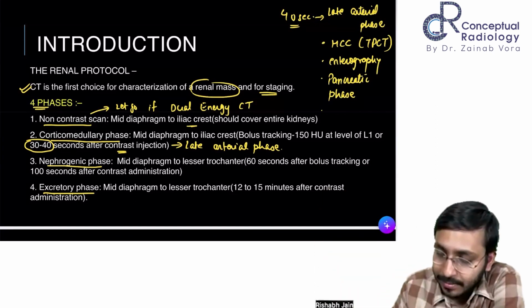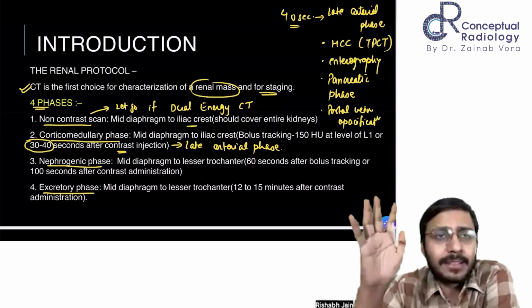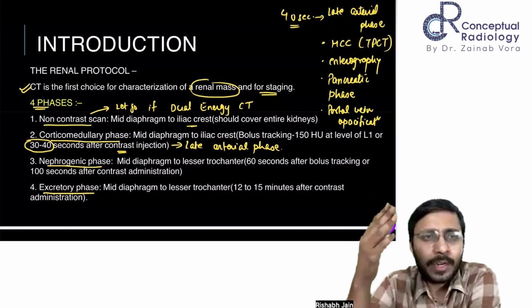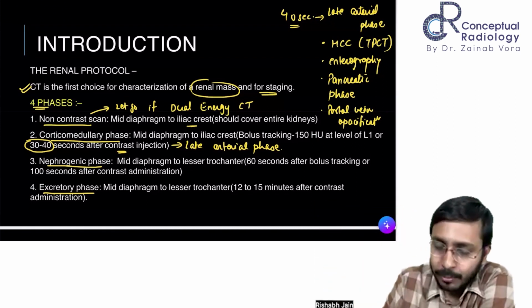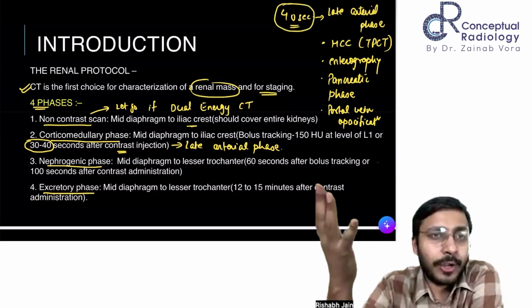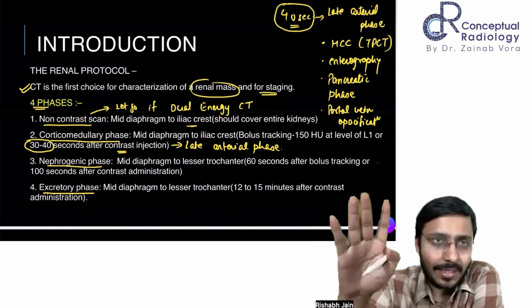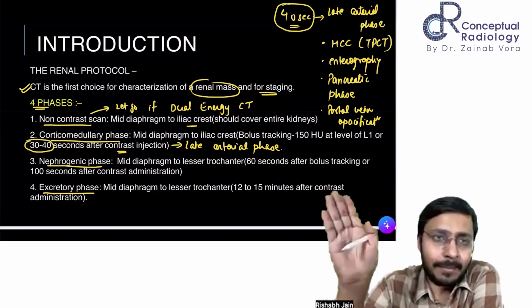And portal vein opacification is also maximum at 40 to 50 seconds, slightly later than the enterographic phase. So remember, whenever phases like corticomedullary, pancreatic, or enterographic are asked, a ballpark figure to remember for your exams is a 40-second timeline.